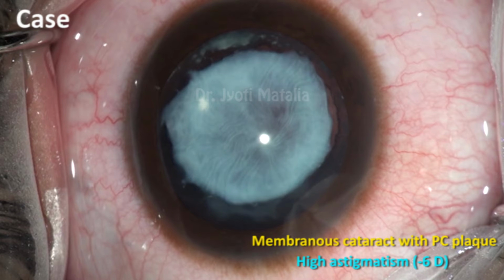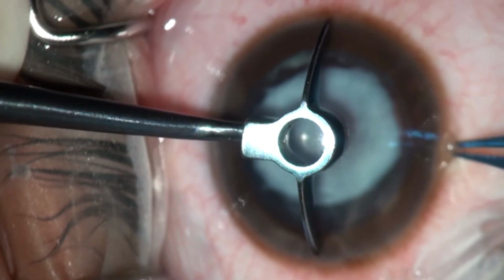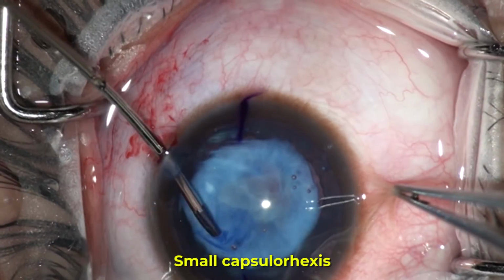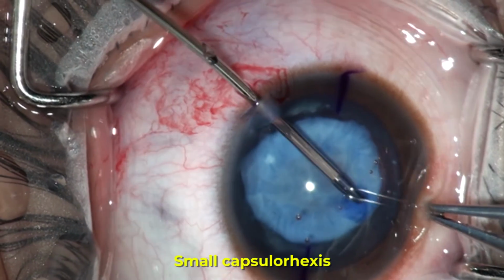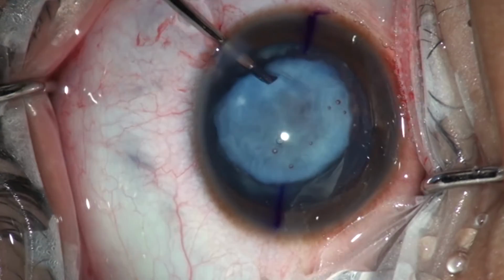Now that we have the SMART TORIC IOL in hand, we would be taking you through the surgical steps. The initial 0 to 180 degree reference marking is being done. Intraoperatively, the same horizontal marking is reconfirmed. Now, keeping in mind the wrinkled nature of the anterior capsule, for capsulorhexis, trypan blue is used, and the trick is to carefully obtain a small sized capsulorhexis due to the wrinkled capsule and then to enlarge it with a micro capsulorhexis forceps and scissors.